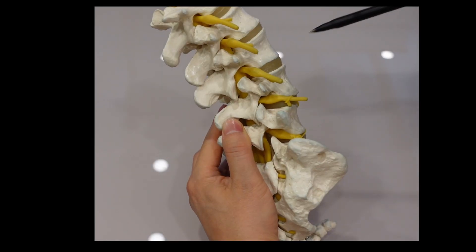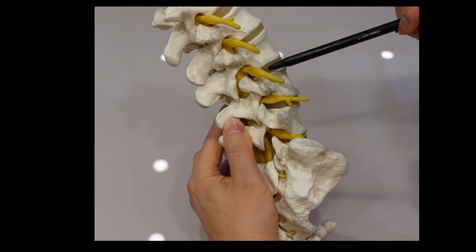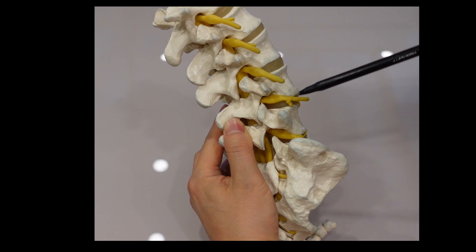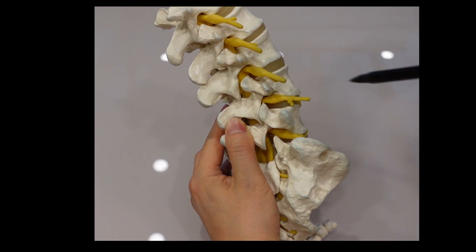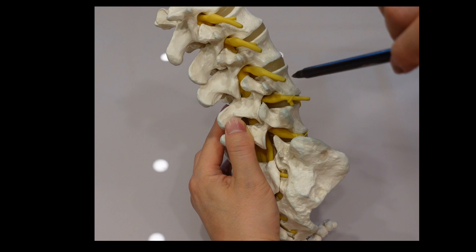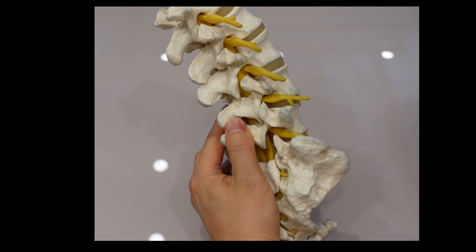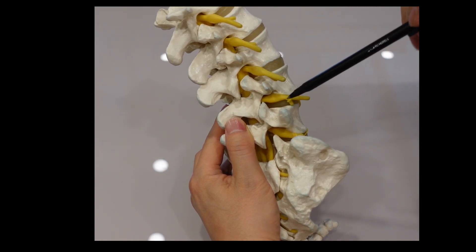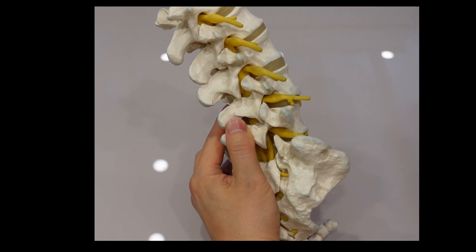The primary indication for the infranural approach is discogenic pain originating from the same level. By directly targeting the posterior surface of the disc, this approach effectively addresses the pain that stems from the intervertebral disc itself.